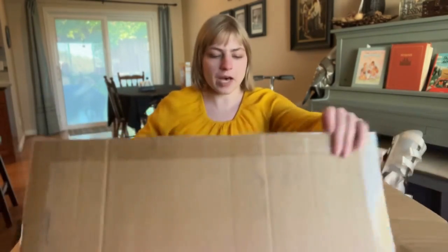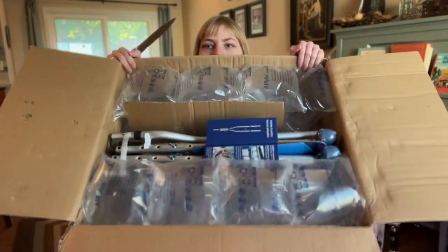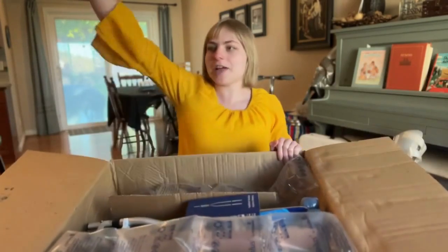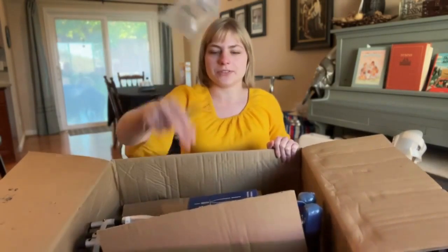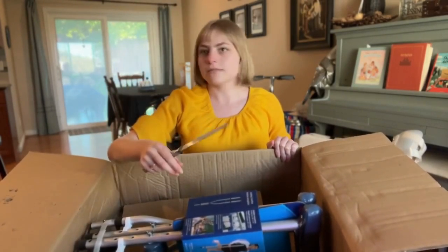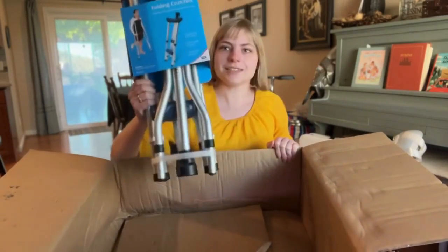Man, this is a big box for such a small thing — like, what the hey, Amazon. Look at this. Bubbles! So many bubbles and more cardboard. I'll pick up my mess later. This is what I'm after!